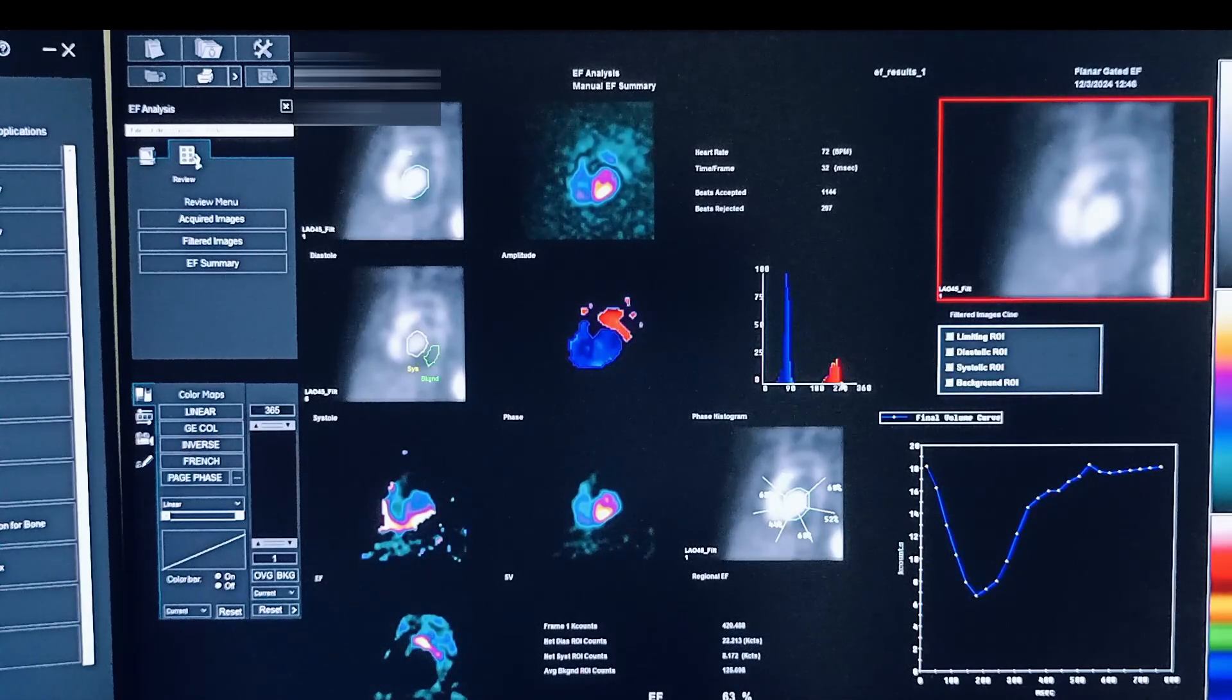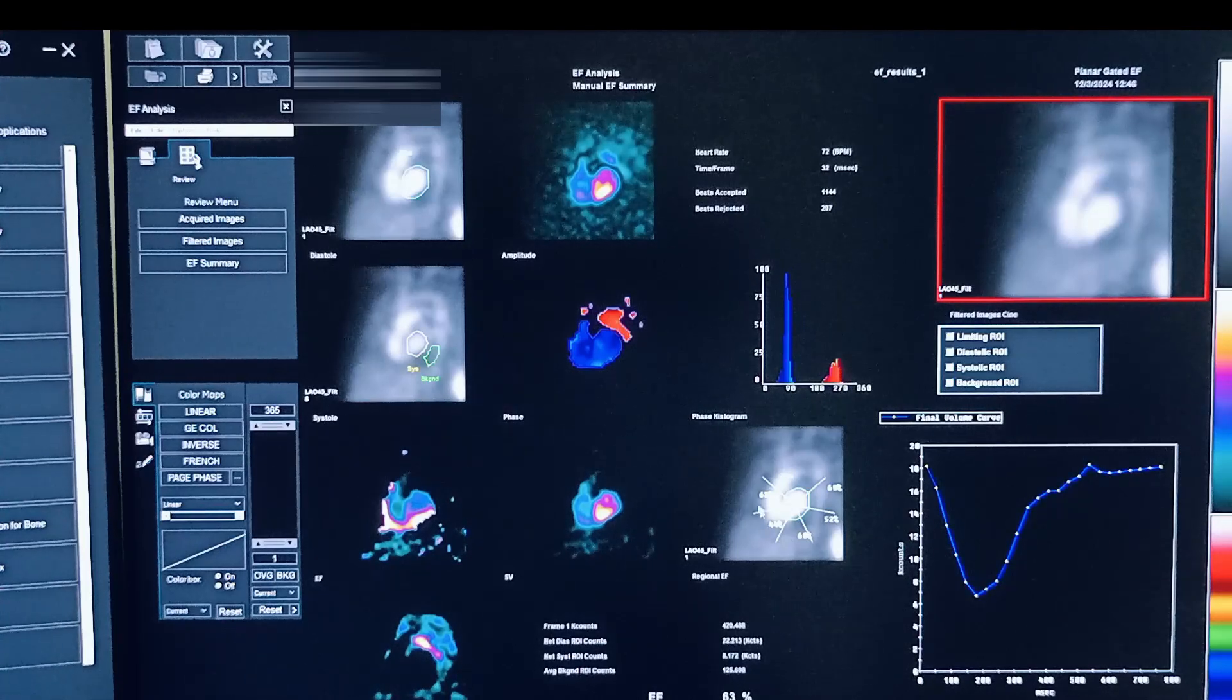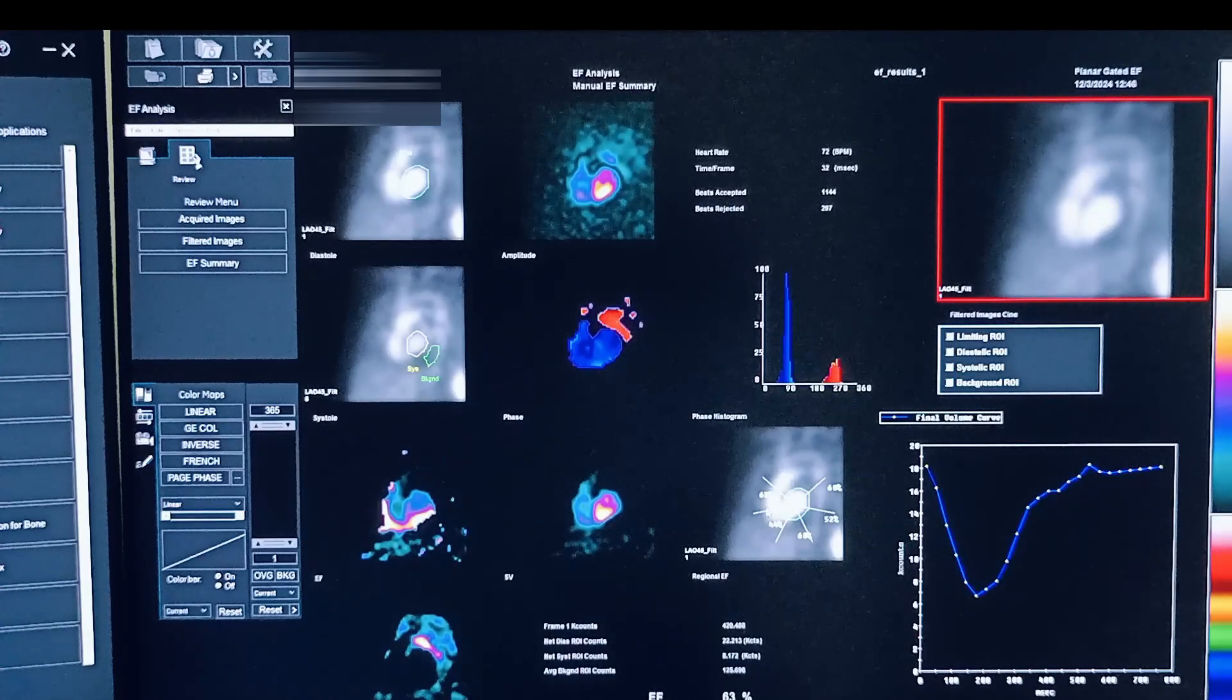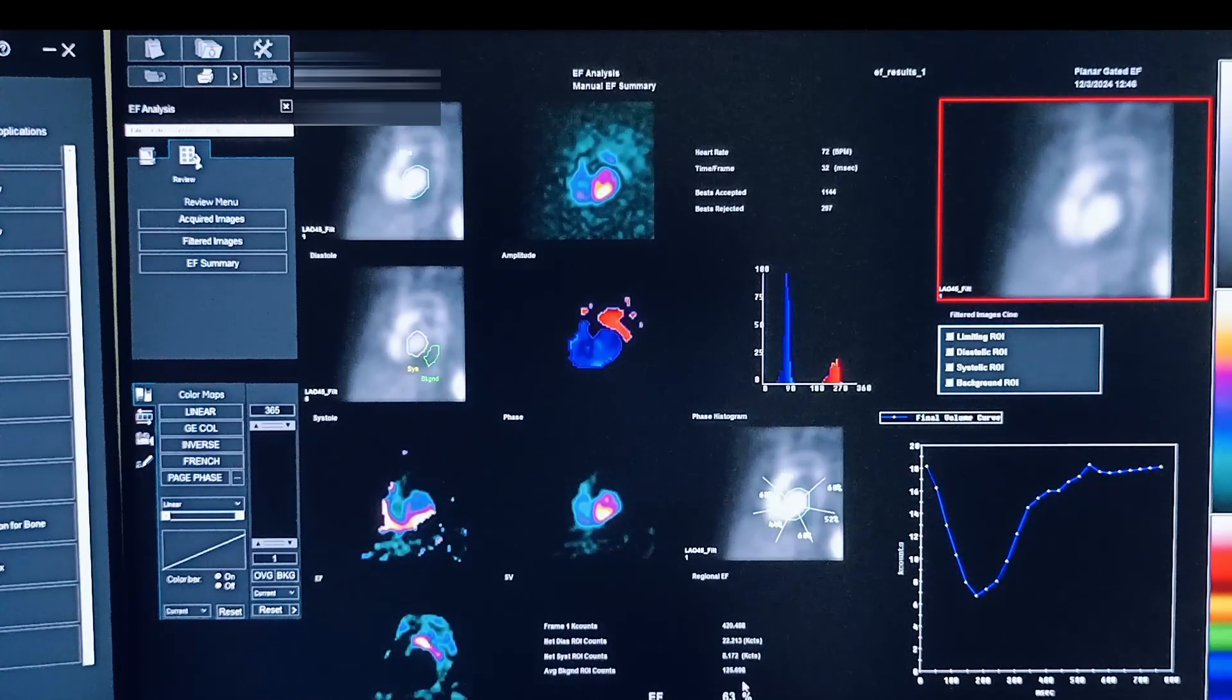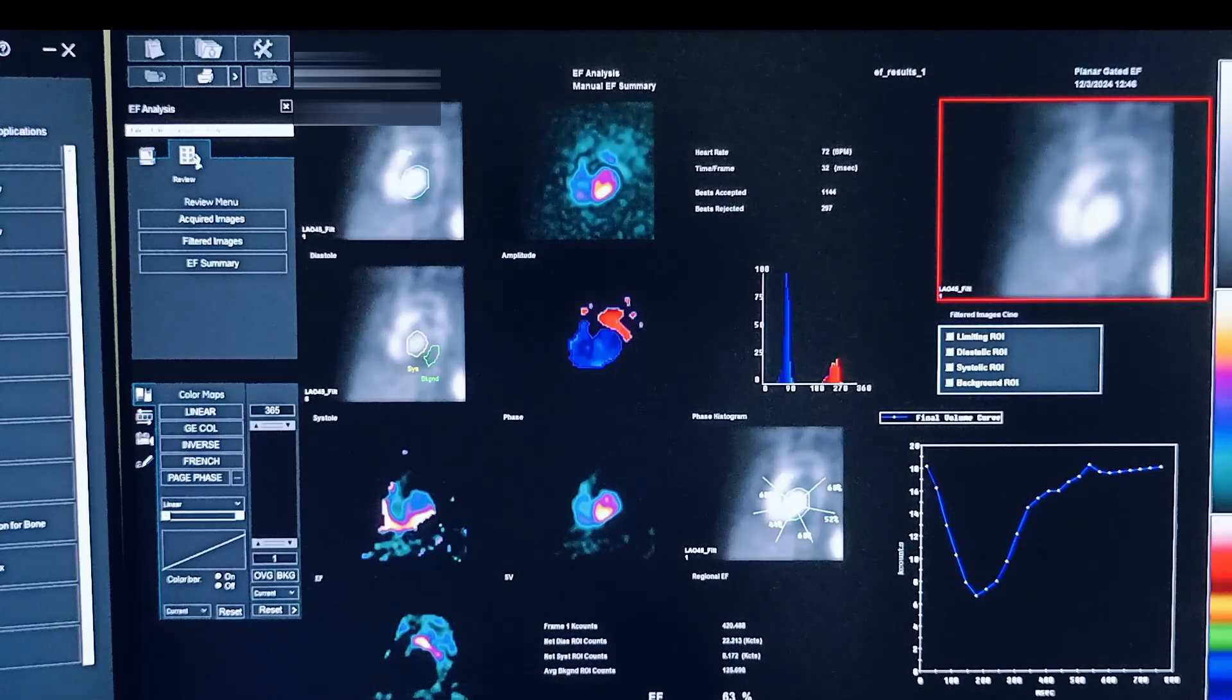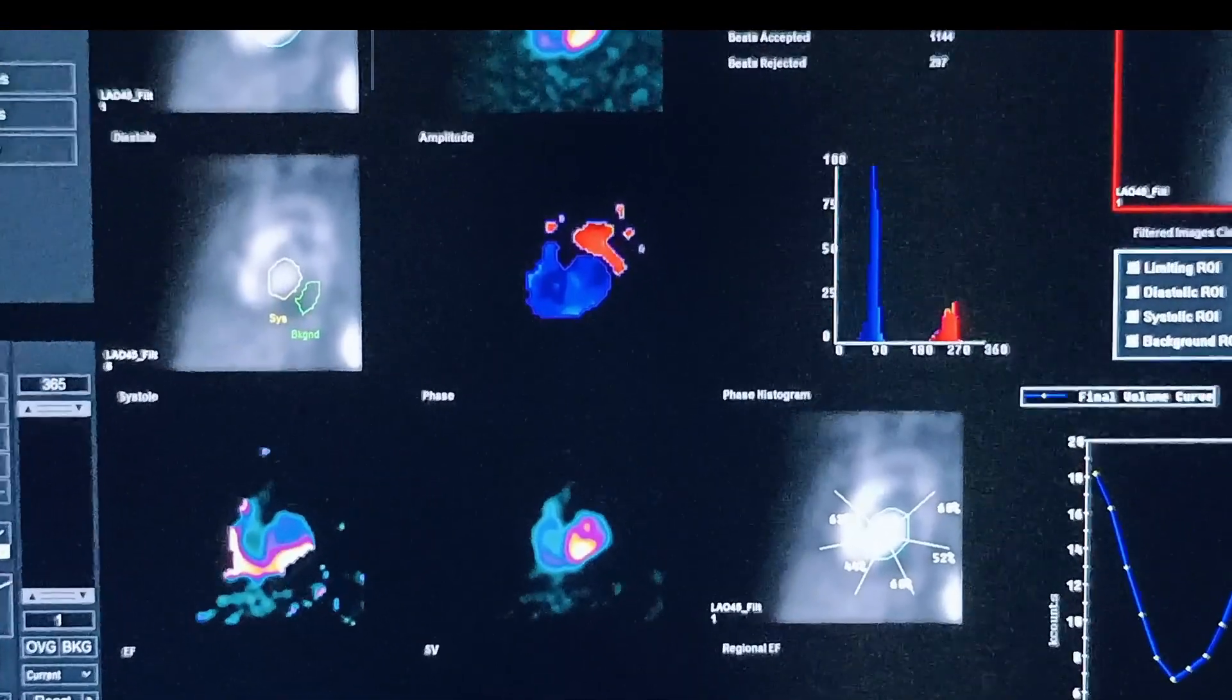This is the phase histogram graph. And these are the regional ejection fraction of the LV. And this is the total EF, that is 63% in this case.